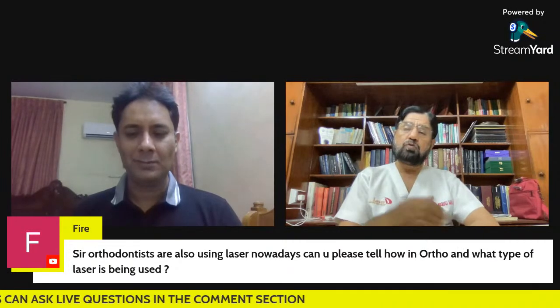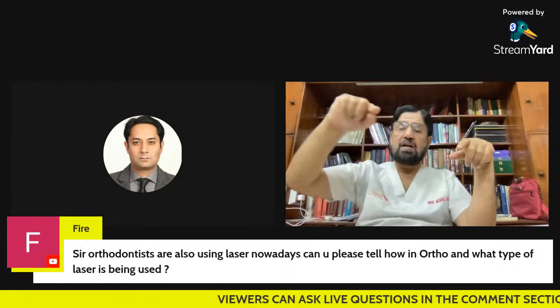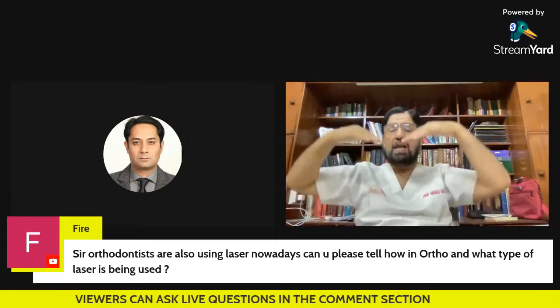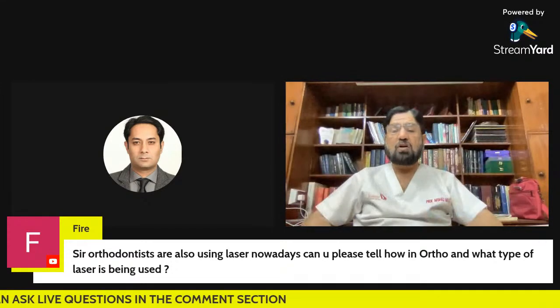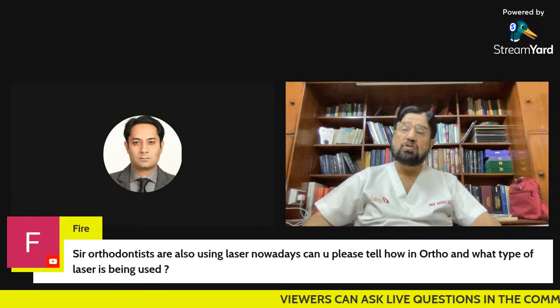Secondly, in orthodontics, sometimes we perform what is called camouflage. In camouflage, we have the gummy smile. In a gummy smile, the gums are more towards the crown, and a certain portion of the crown is hidden within the gums. So whenever the patient smiles, there is more exposure of the gums than the teeth. So we cut the gums and elevate the visibility of the crown, which is called crown lengthening.